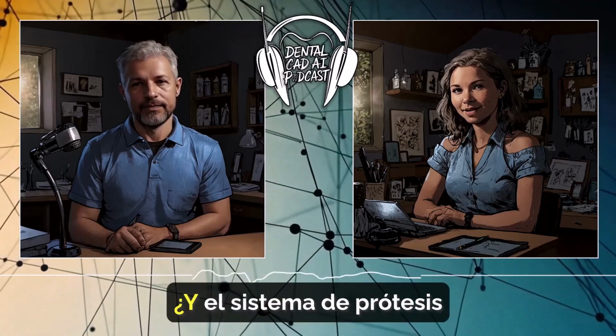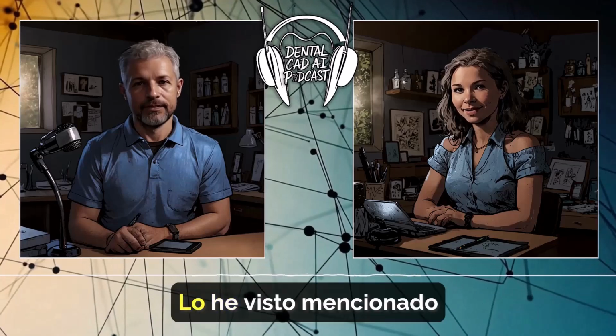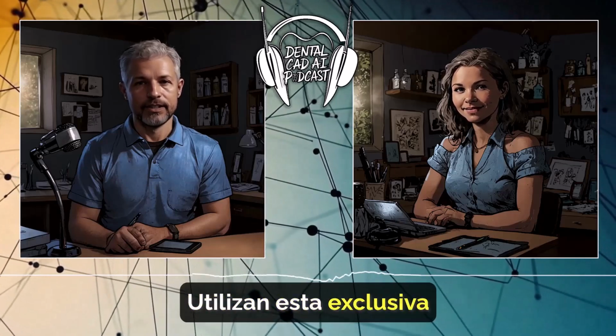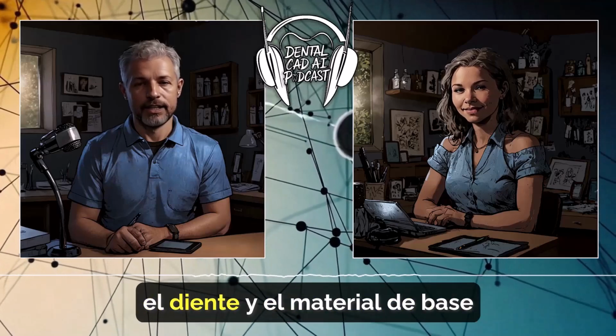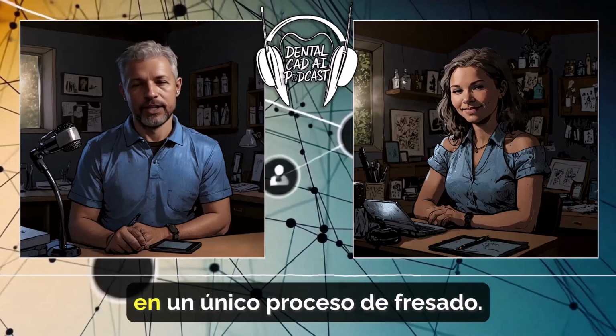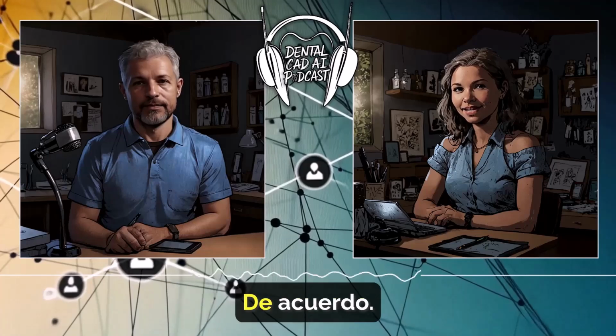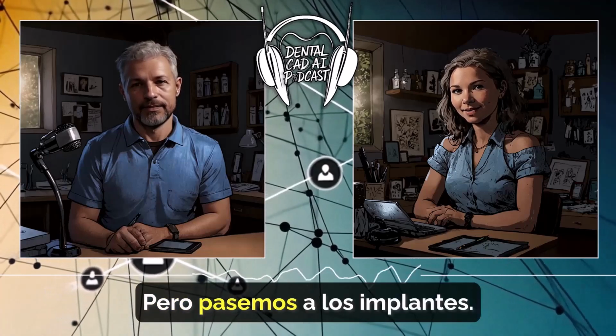That's amazing. And what about the Ivotion denture system? I saw that mentioned somewhere. Oh yeah, that's a fascinating integration. They're using this unique disc technology that combines the tooth and base material into a single milling process. So it's like all in one. Exactly. It's super efficient and precise. Okay, now that's what I call innovation, but let's move on to implants.